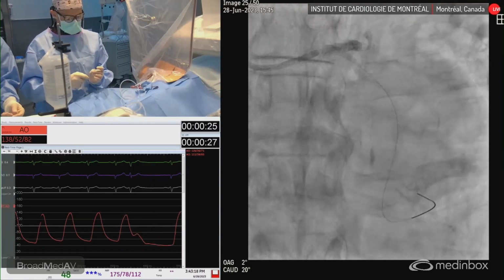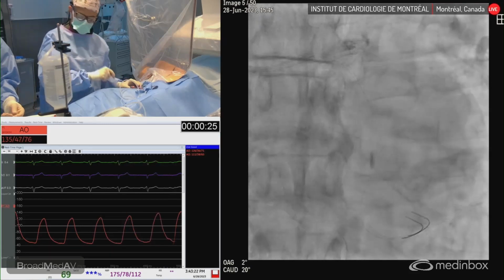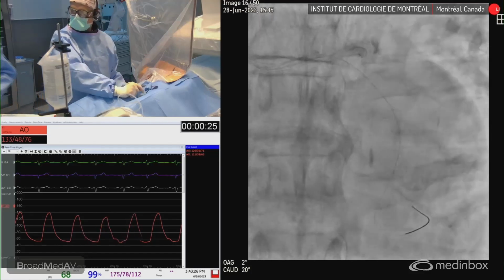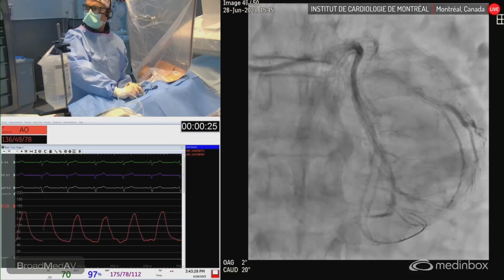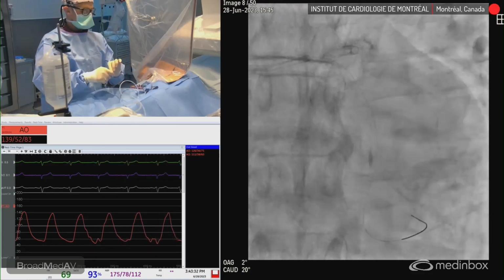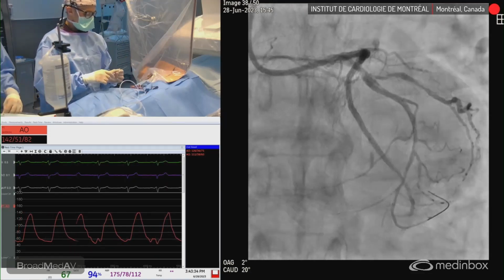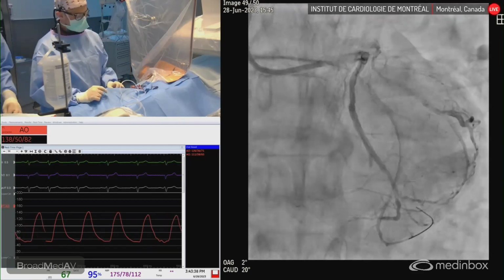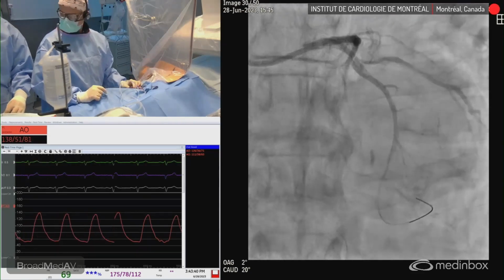Like the Rotaglide, but yeah. Okay, another blue towel. Okay, blue towel, please. So blue towel, and a clamp. Yeah, it's called Viper Slide, 20 cc and 1000 normal saline. So that's the cocktail.